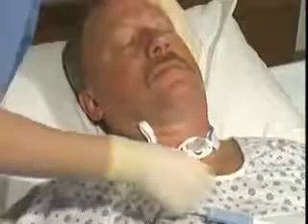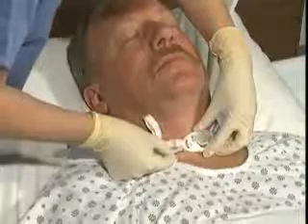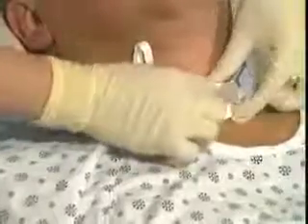Next, bring the neckband behind the patient's neck. Thread the remaining fastener tab through the flange and fasten it back onto the neckband.